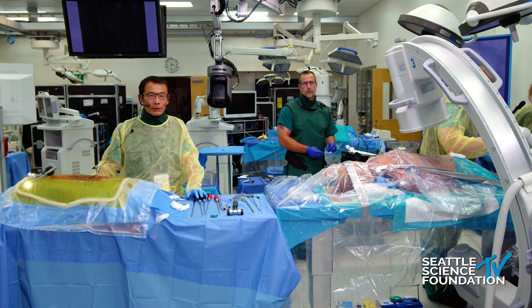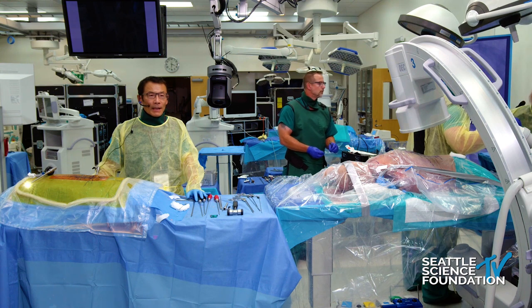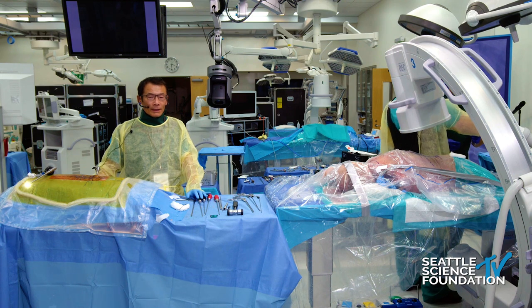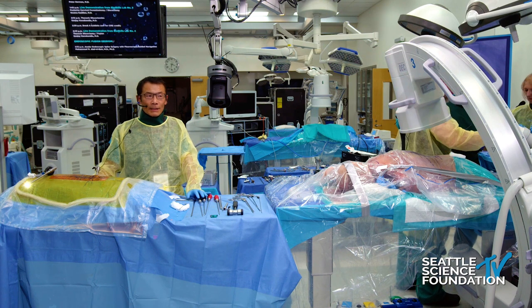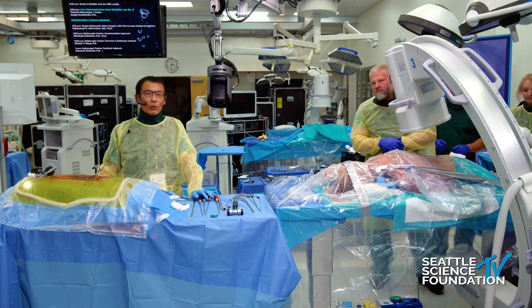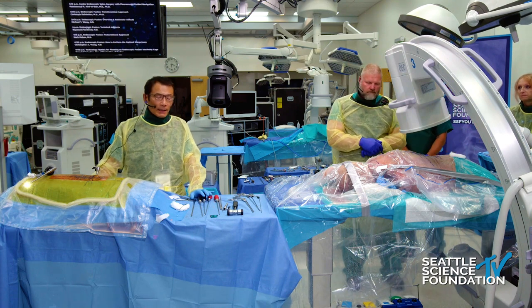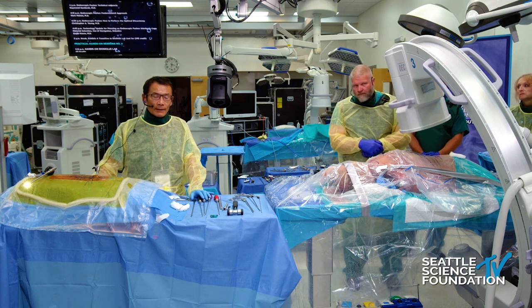So this is where the endoscopic technique really shines, because it really enables you to do a very good discectomy and end plate prep. As a matter of fact, you can actually go all the way anteriorly to the ALL, you can release the ALL under direct endoscopic visualization, so achieve better lordosis. That's your anterior release. Number three, you want to achieve adequate decompression. So depending on where the pathologies are, you can choose transforaminal or interlaminar approach.